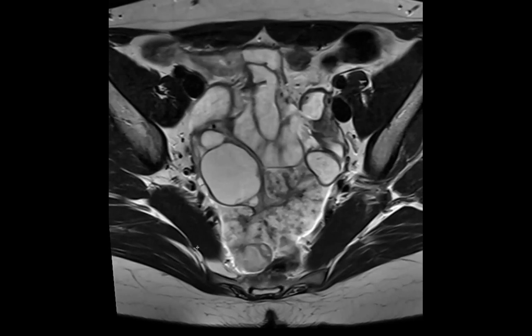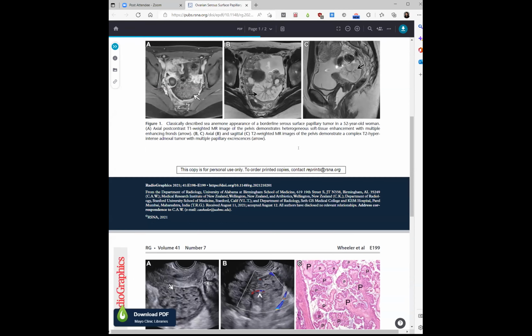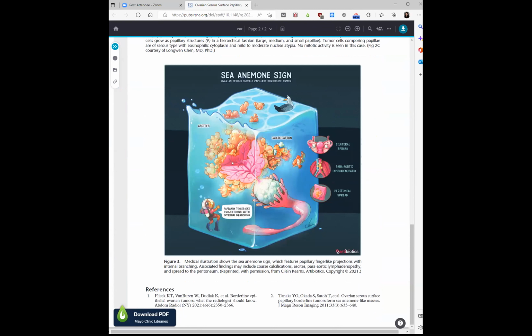Cool. I feel like it looks more like a broccoli or cauliflower or something. I'm not sure about sea anemone, because a sea anemone should have tendrils. All right, well, you can argue with the individual that came up with the descriptor. Cool, but it looks like this is maybe a pathognomonic thing for this. And these are malignant or what?